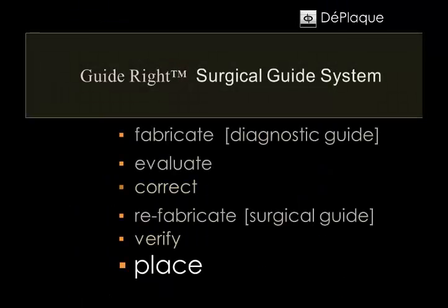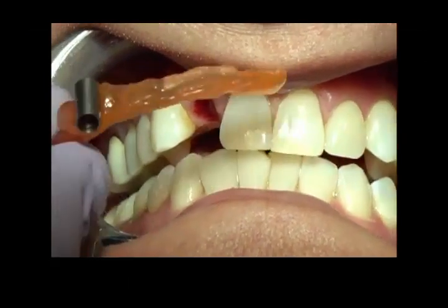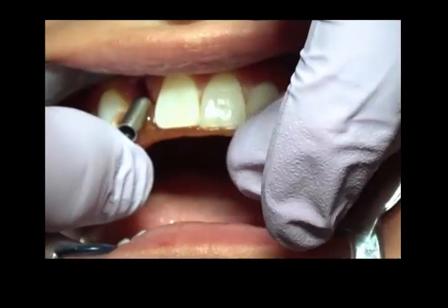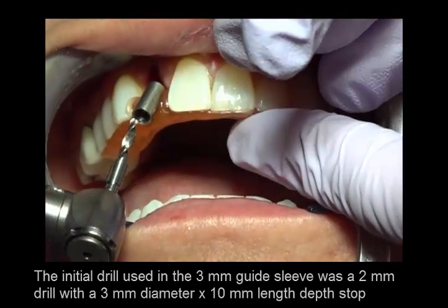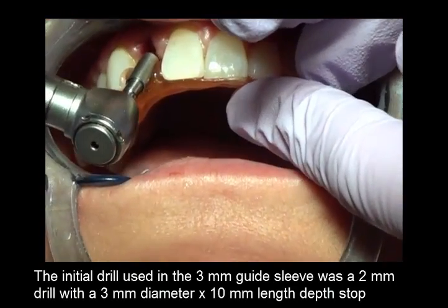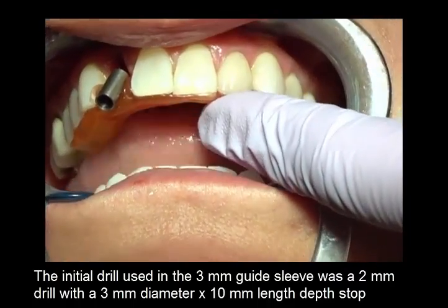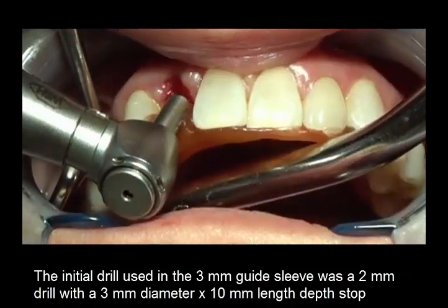The next step is to anesthetize the patient, remove the lateral incisor, and place the implant. The surgical guide is inserted, being sure that it is seated on the adjacent teeth. The initial drill used is in the 3 millimeter guide sleeve with a 2 millimeter drill with a 3 millimeter diameter by 10 millimeter depth stop.